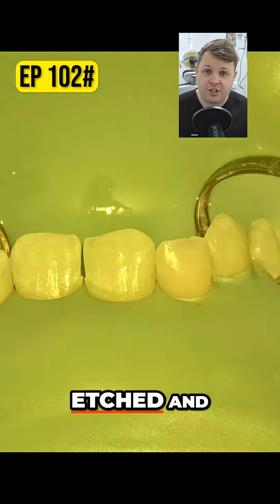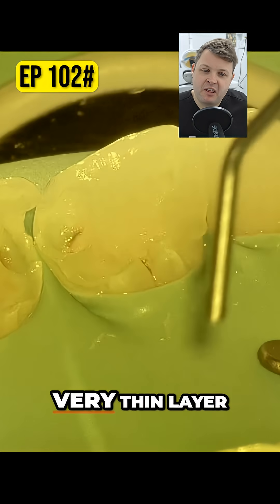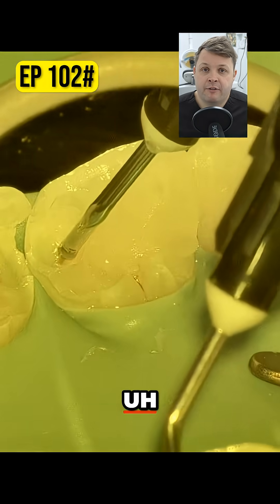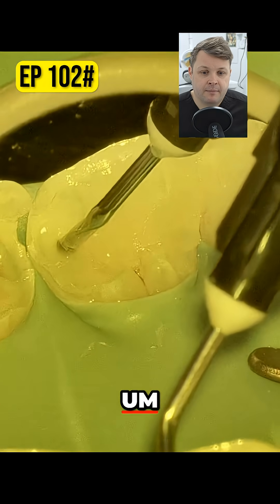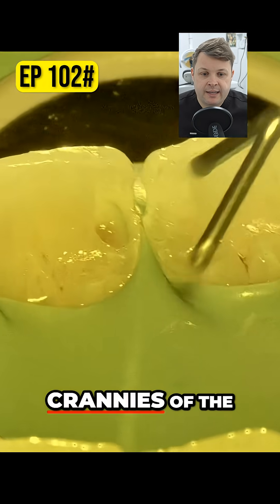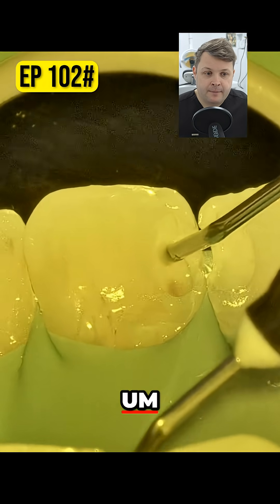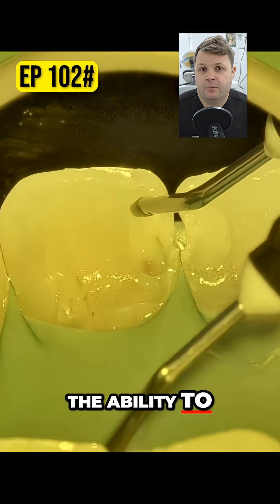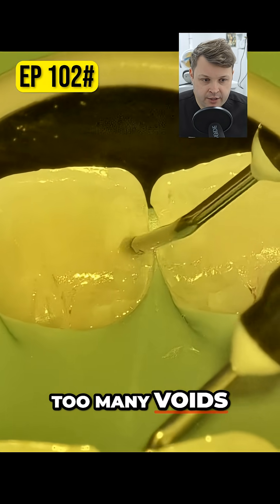What you'll notice is once we've etched and once we bond, I like to flow a very, very thin layer of flowable composite in the base of the cavity. This makes sure you flow it into all the little nooks and crannies of the cavity, and it also provides you the ability to place your composite without getting too many voids.